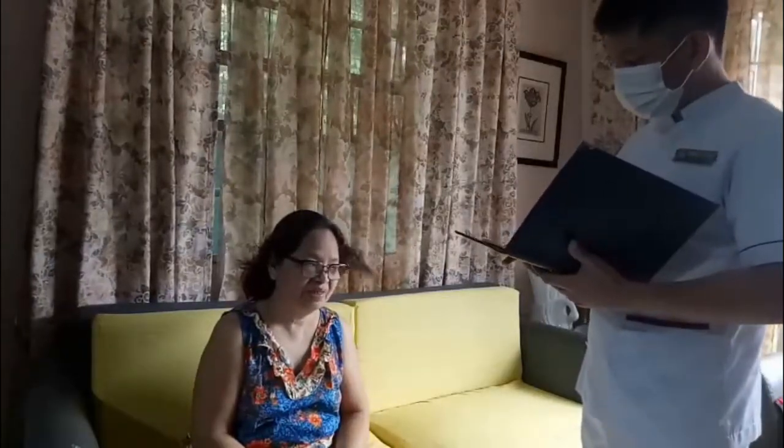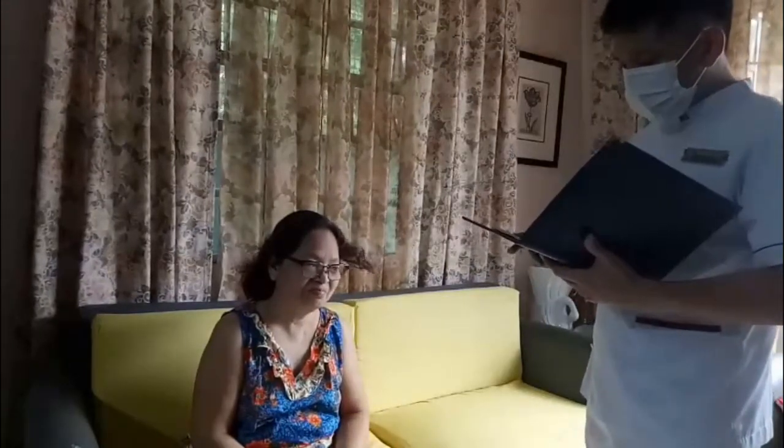Good morning, ma'am. Ma'am Ramos. Yes. 64 years old for cervical diagnostic X-ray, po. Okay.